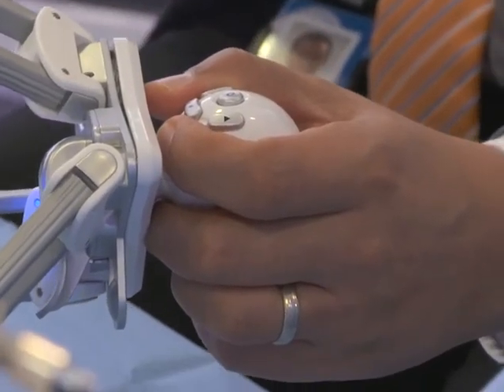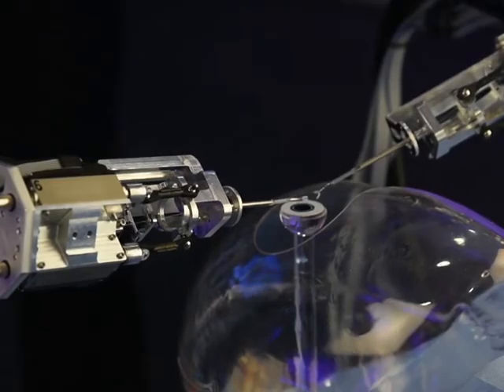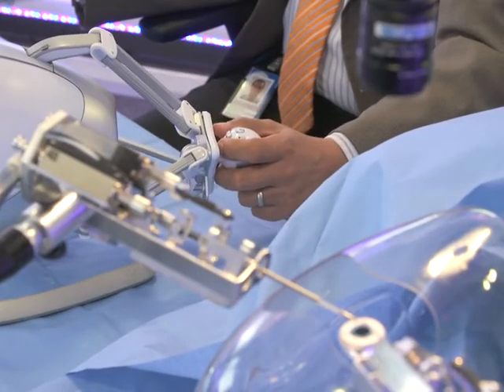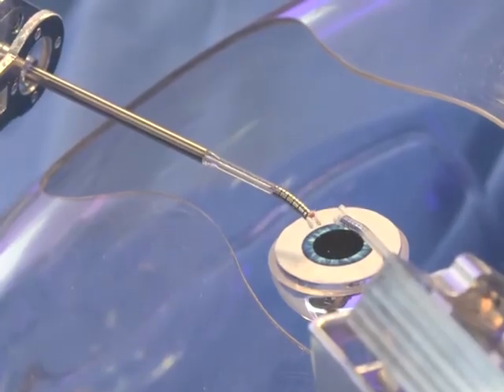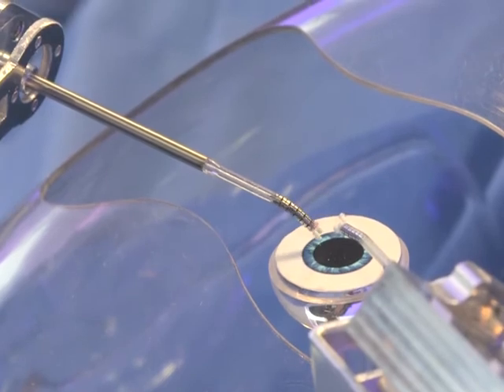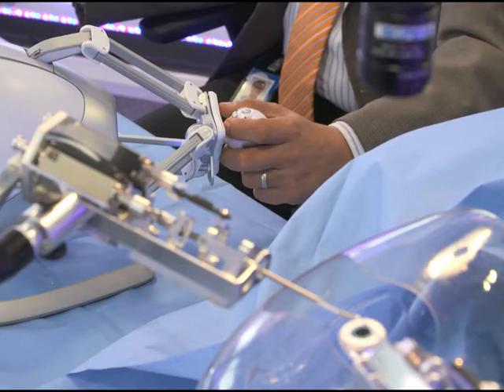So what we've done is, instead of using a straight articulator, we've moved all the movement to the inside of the body and use a flexible instrument or articulation mechanism. So nothing moves on the outside of the body. The robot on the outside of the body doesn't move, and that reduces the range of motion outside of the body. That means the robot can be smaller, and it also improves the safety aspect. No large arms are moving around that can whack the attending surgeon or a nurse who's sitting beside the patient. Those are several ways that we're making the trade-off.